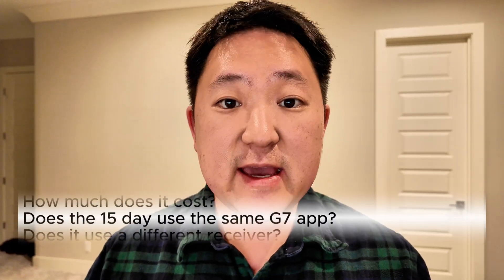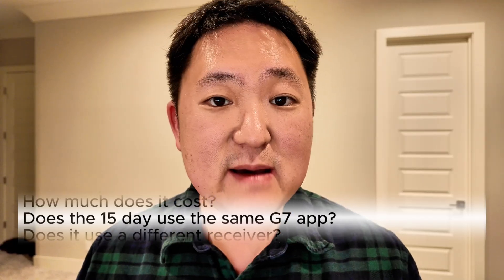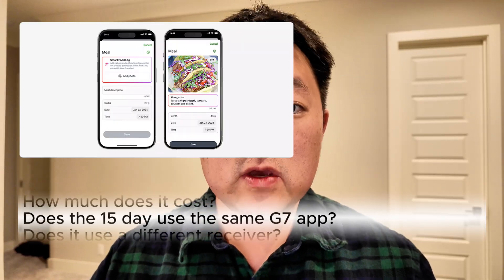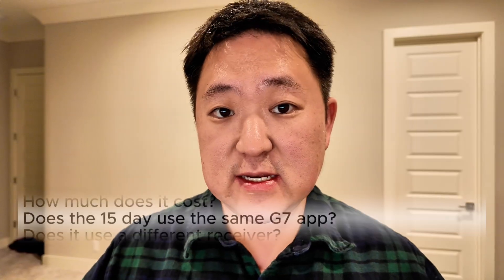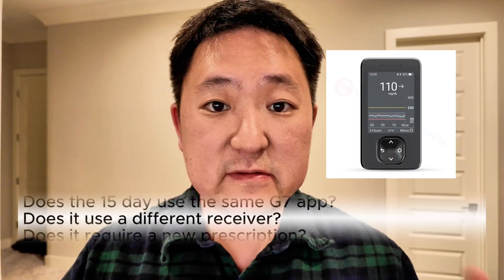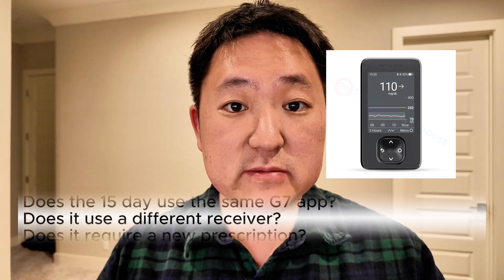Both the G7 15-day and the 10-day version will still use the same exact Dexcom G7 app. This means that all the new app-based features such as the smart AI food logging will be available for people using the Dexcom G7 10-day or 15-day sensors. Similarly, the G7 15-day and 10-day versions will still use the same exact Dexcom G7 receiver.